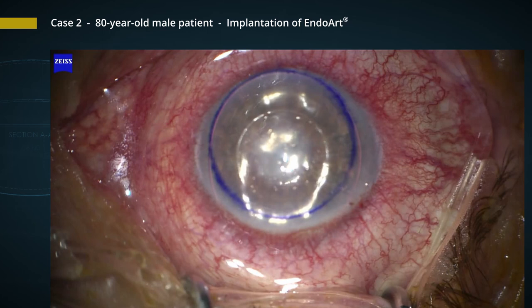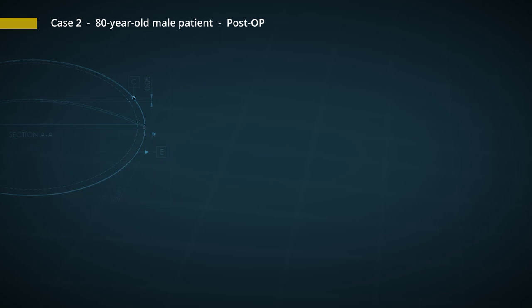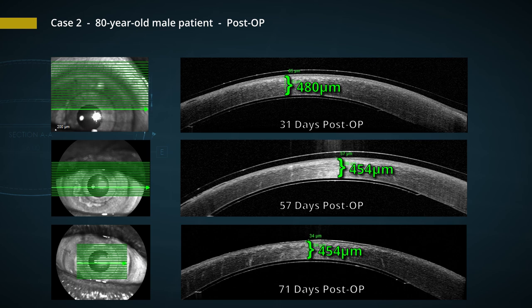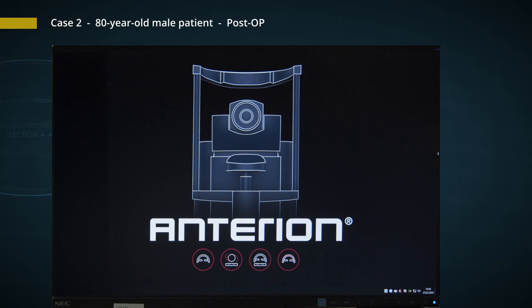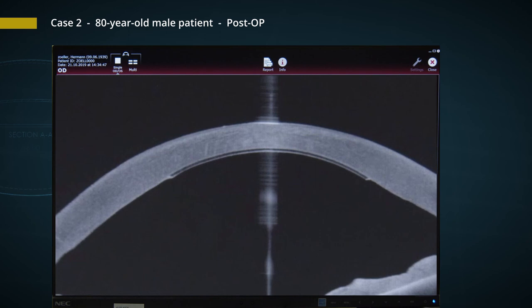Already on the first day post-op, the patient had a decreased corneal thickness of 487 microns. Here you can see the development over the following months: the cornea remained between 450 and 480 microns, giving us a normal thickness of the corneal stroma with no water inside the stroma anymore. Here we see anterior OCT imaging of patient number 2, showing how nicely the implant is attached to the posterior surface of the cornea, with excellent adhesion in all meridians.